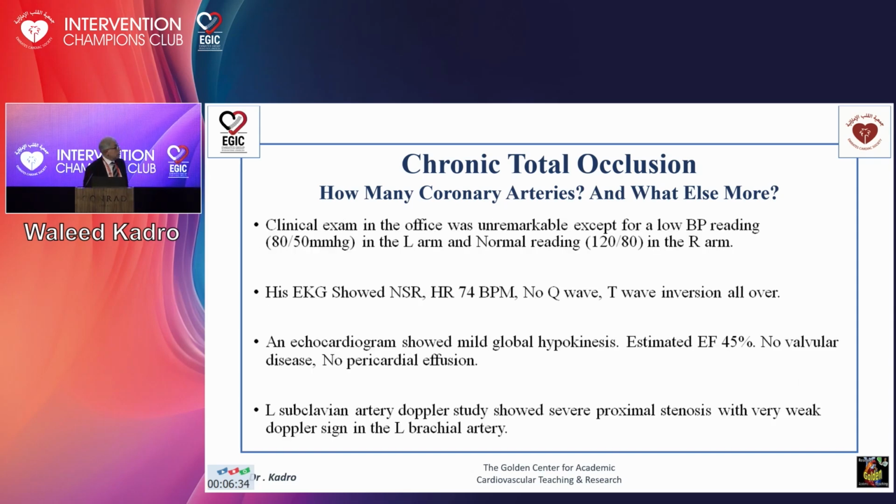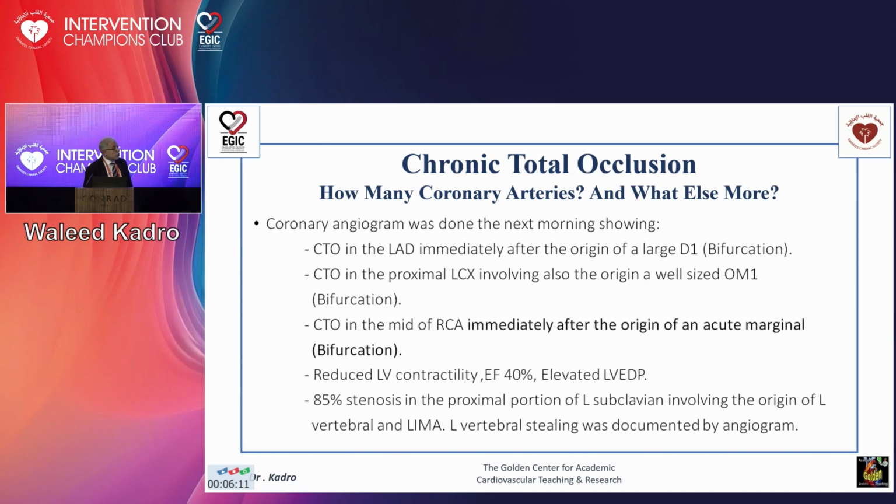On the exam, what we noted was that his blood pressure on the left hand is lower than the right hand. His ECG showed normal sinus rhythm and no Q wave, but T wave inversion all over. Echocardiogram showed mildly reduced LV function, ejection fraction 45%, and the Doppler of the left subclavian showed severe proximal stenosis.